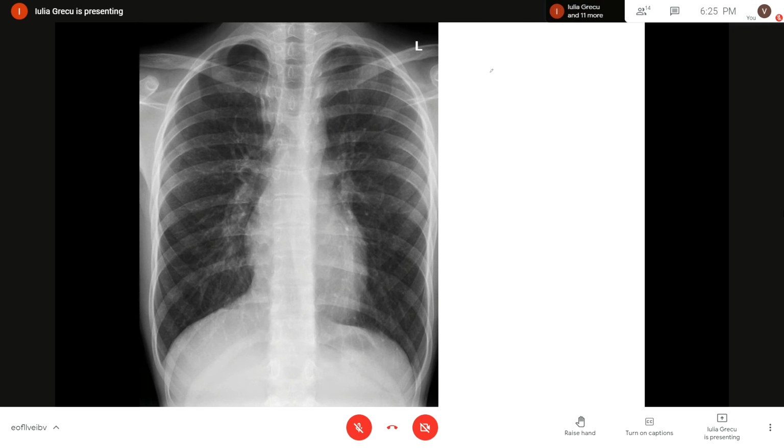Like a chest ultrasonography? Okay, to see pneumothorax, especially in these small quantities, is very difficult to do by chest ultrasound. I'm not saying it's not possible to view pneumothorax by ultrasound in some special settings, but it is not the elective imaging modality.